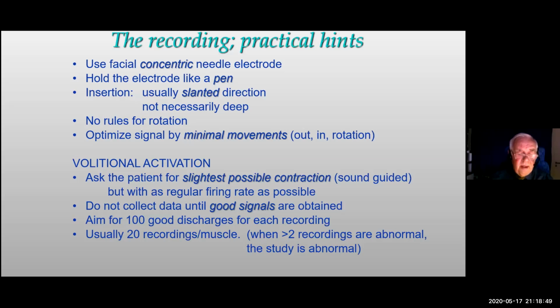The biggest problem is that we ask the patient for too much activity. We should ask the patient to relax, relax, relax, so that we have only very few motor units active, and they should fire with a relatively low but regular firing rate. I do not start the software to collect data until I see a very good signal.